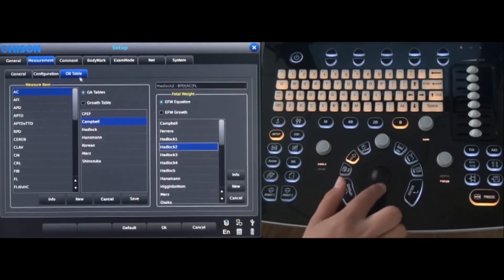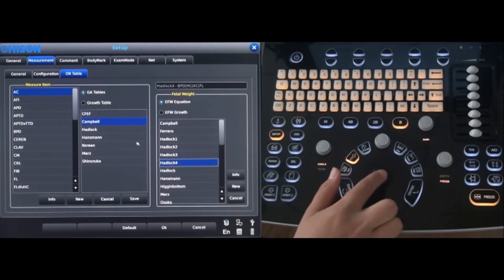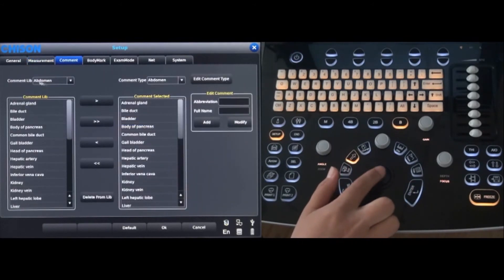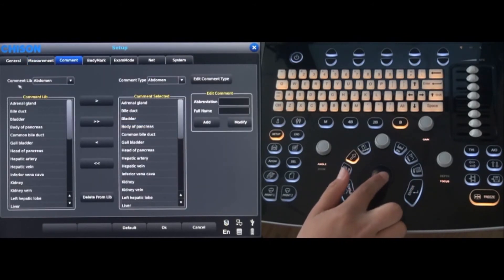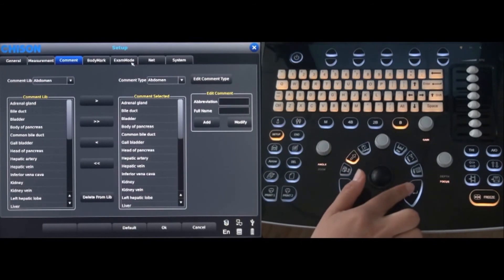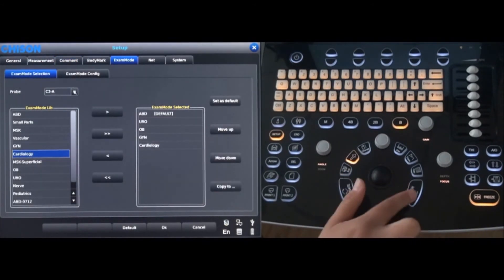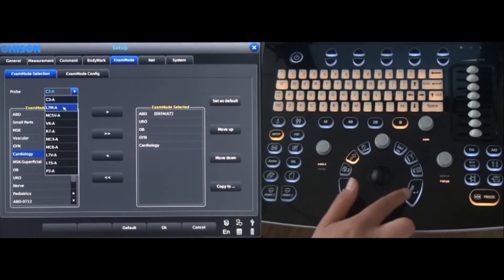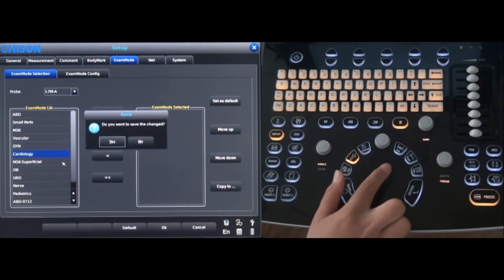The OB table tab has many options, including fetal weight. Select the comment tab and the comment library can be set up. The exam mode allows you to add different probe presets — choose the probe first, select the type of exam, and add it to the list.